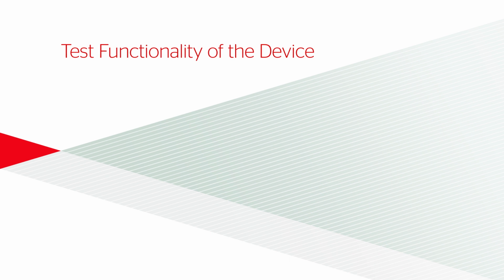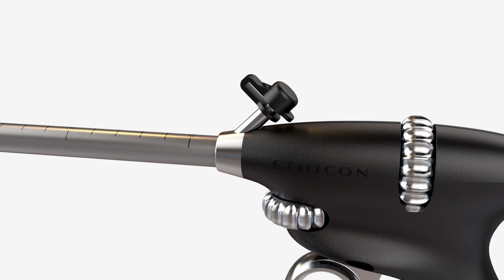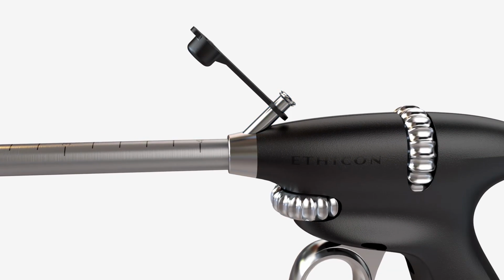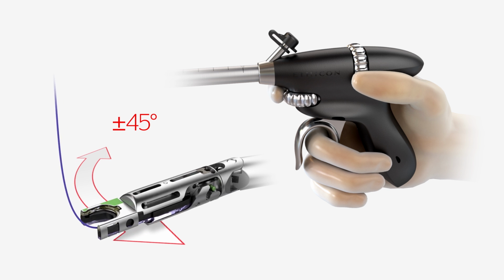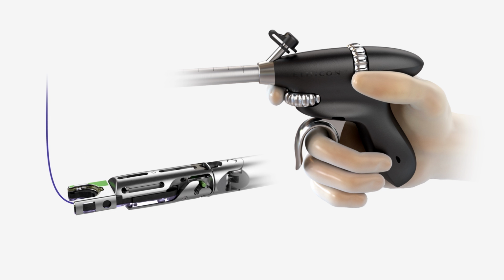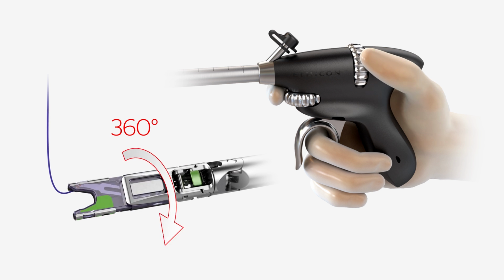Test functionality of the device. To ensure the device was properly prepared during sterilization, the device should be received with the flush port in the open position. Prior to each use, test the functionality of the instrument to ensure that the device has not reached the end of its useful life. Use the rotation and articulation knobs to test that the device can articulate 45 degrees in both directions and rotate 360 degrees in both directions without excessive force.